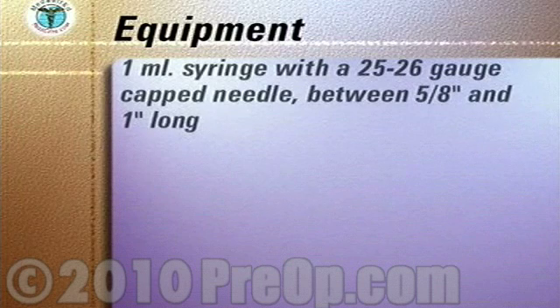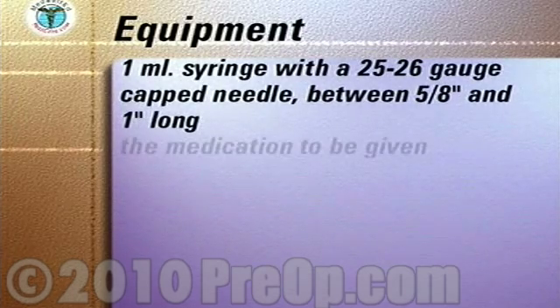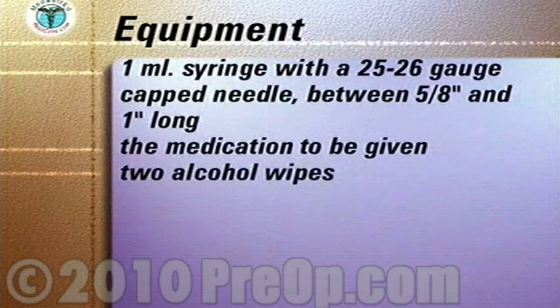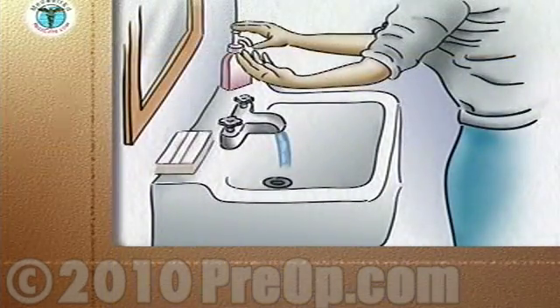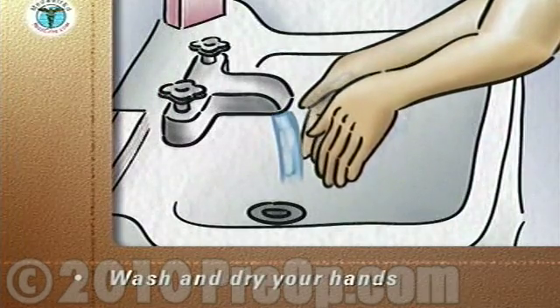The equipment you will need to assemble includes a 1 milliliter syringe with a 25 or 26 gauge capped needle between 5/8 of an inch and 1 inch in length, the medication to be given, and 2 alcohol wipes. Carefully wash and dry your hands.